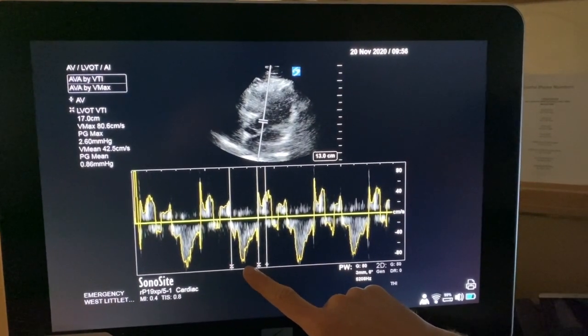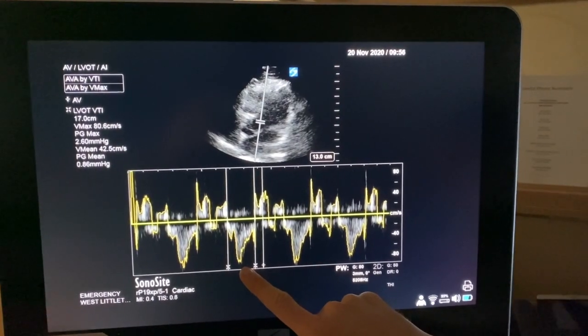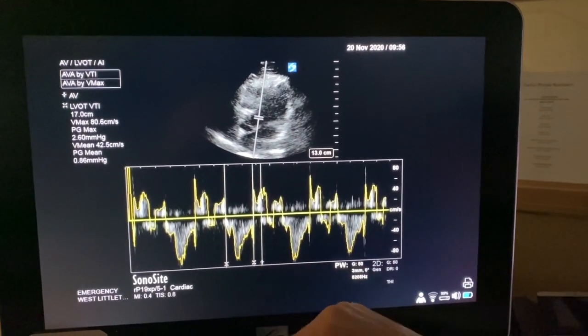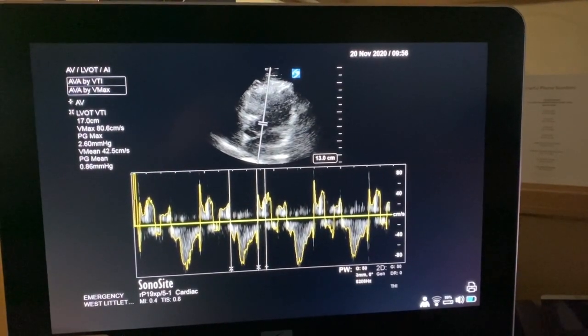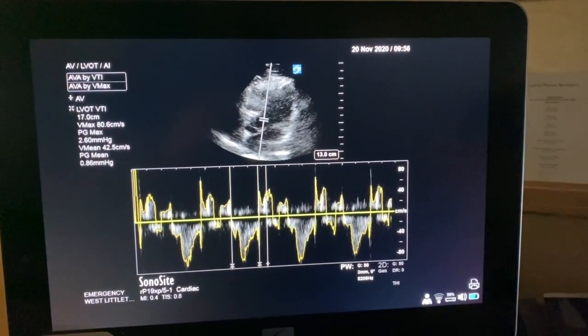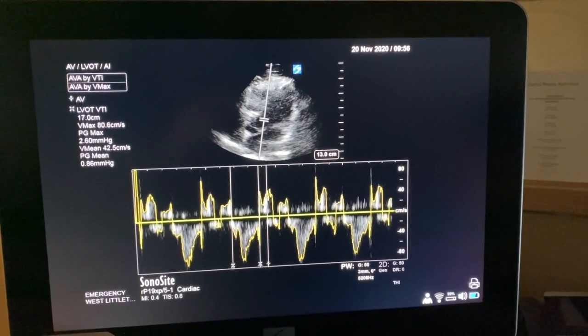The idea would be to do the VTI in somebody before an intervention, and I would suggest a passive leg raise, which would give somebody essentially an immediate 500 milliliter bolus of blood. Repeat this measurement, and if your VTI increases, then that suggests that the patient is volume responsive. If there's no change or a decrease, it would suggest that the volume you just gave to the body actually decreased the cardiac output. It would be a time to use vasopressors.